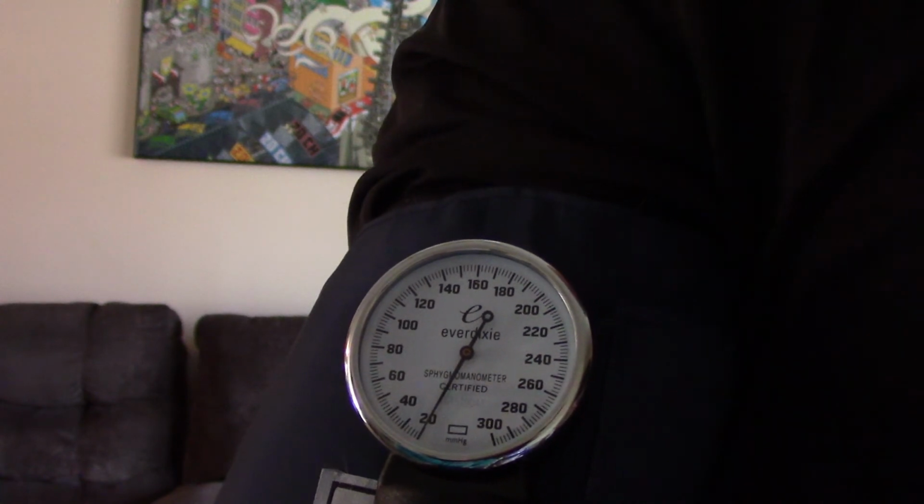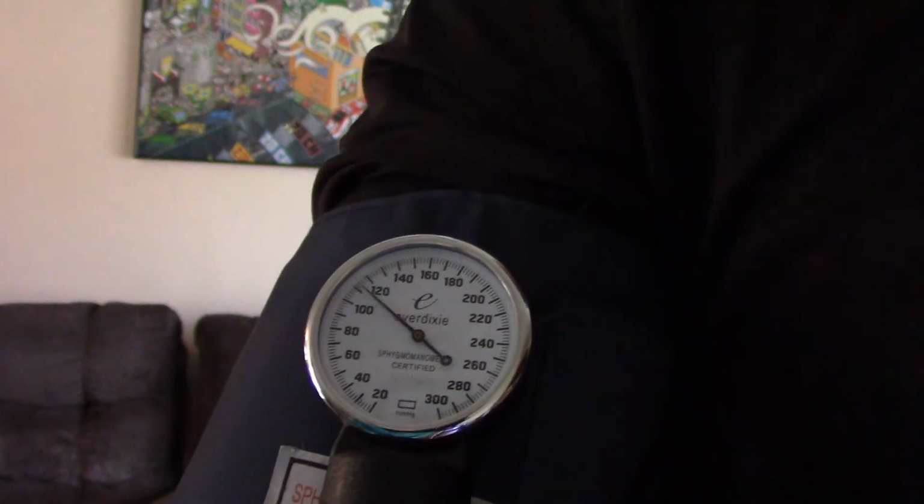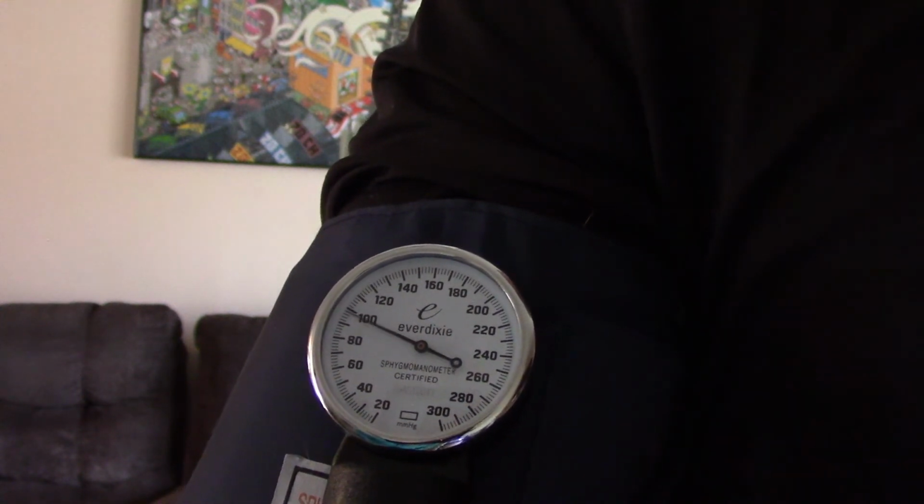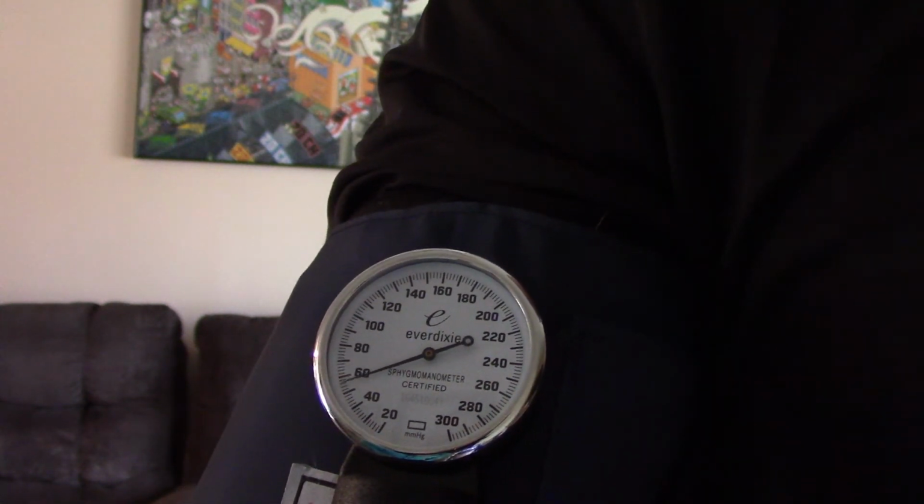Now let me show you once how you would do it wrong. Twice actually. So you could go way too fast. That's way too fast. You wouldn't be able to hear the heartbeats effectively.